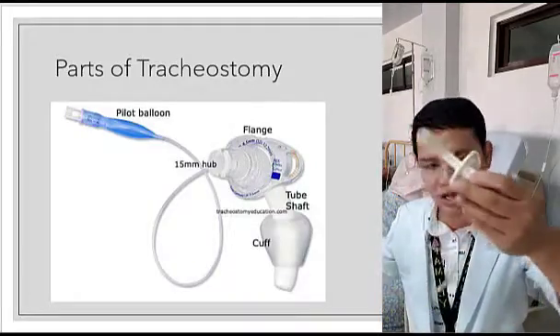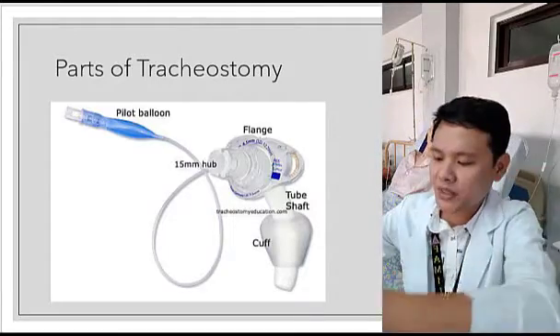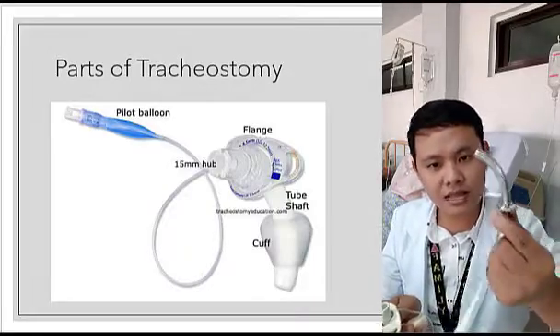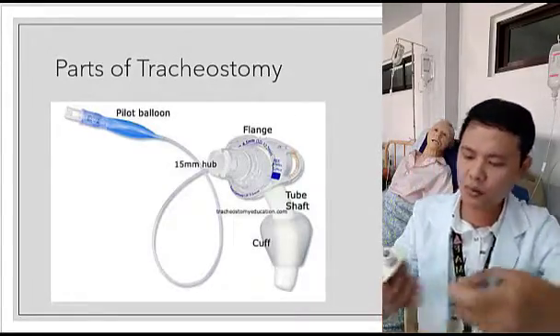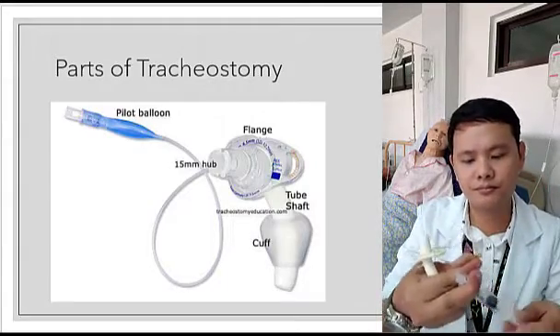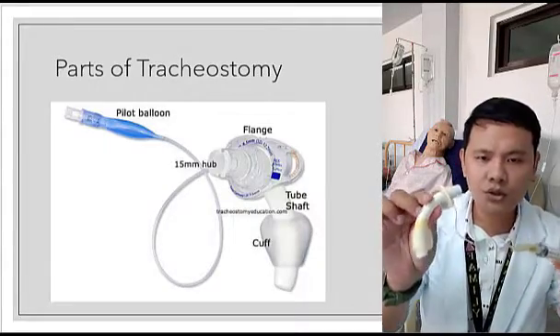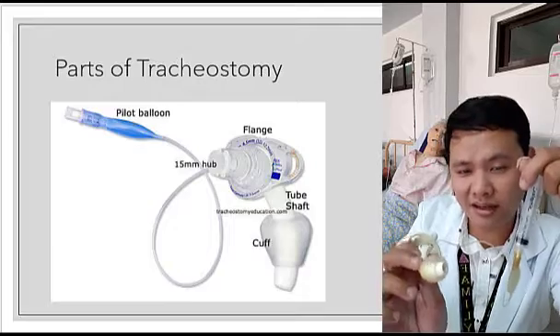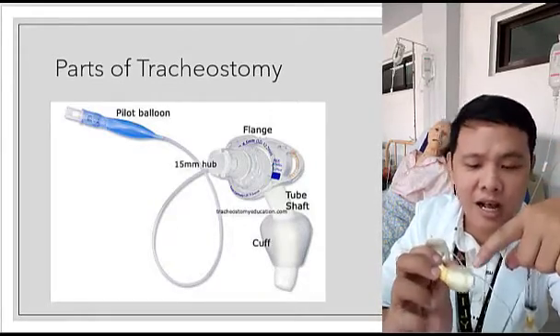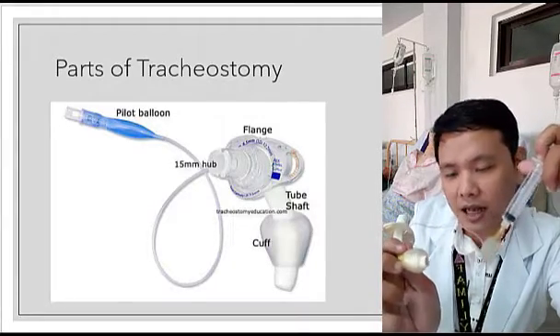Okay, here also we have, meron silang mga pilot balloon. This one is used to inflate the cuff. Okay, but for this one, as I have told you, the metal doesn't have. So, huwag kayo mako-confuse, ano? I'm using air here. Okay, I cannot use water because if ever na magkaroon dito ng puncture, ang tubig po pwedeng pumunta sa may baga. Okay, so what I'm using here is air.